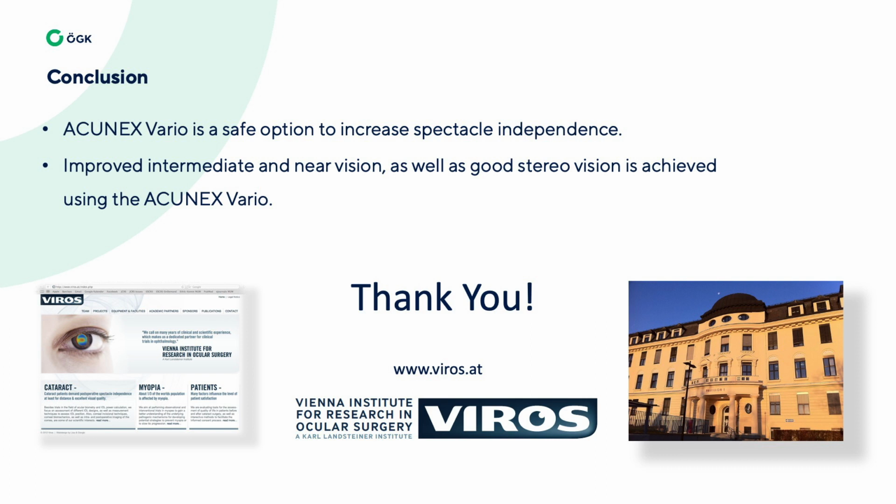So to conclude, the ACUNEX Vario is a safe option to increase the spectacle independence and improve intermediate and near vision, and good stereopsis is achieved when you use the ACUNEX Vario.